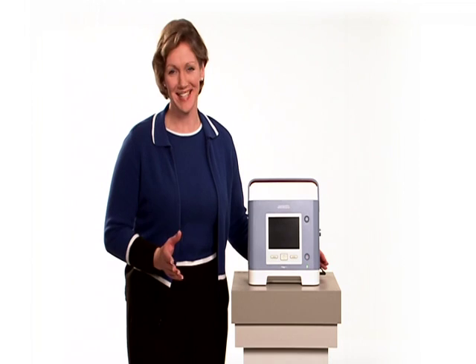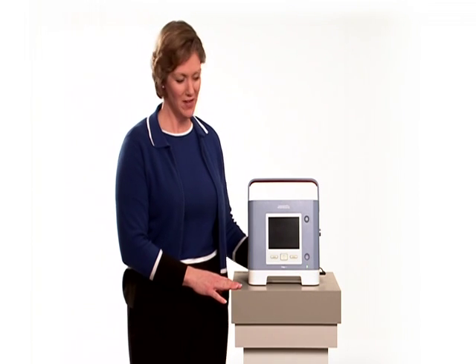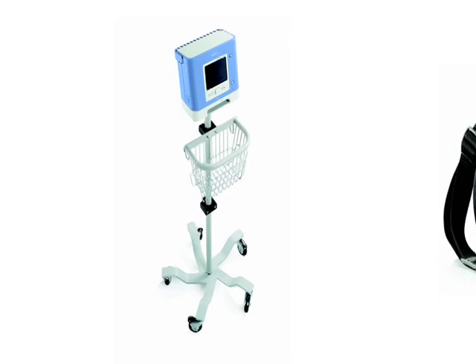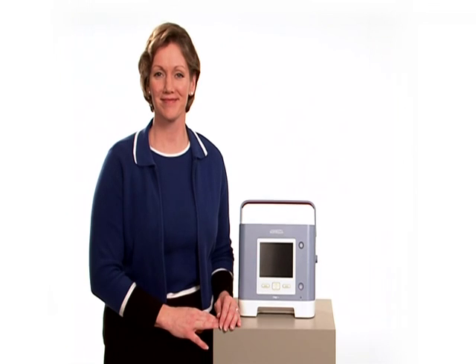Trilogy100 is easy to set up for home use. Begin by placing it on a hard, non-carpeted level surface. You can also place Trilogy on a stand or set it inside the optional in-use bag. Make sure that the air inlet port on the back of the device is not blocked and that air can flow freely around the unit. If the airflow is restricted, the ventilator may not work properly.